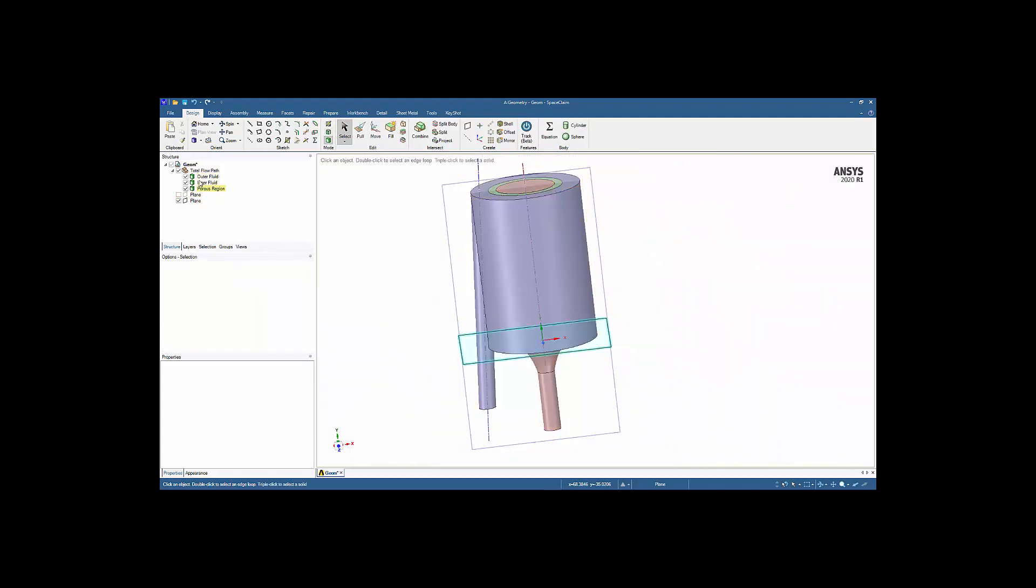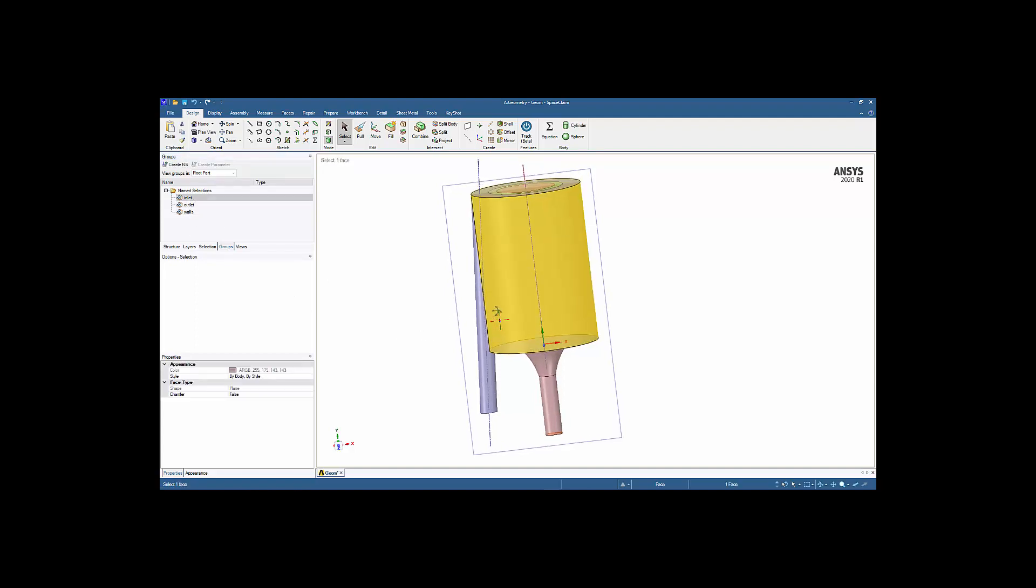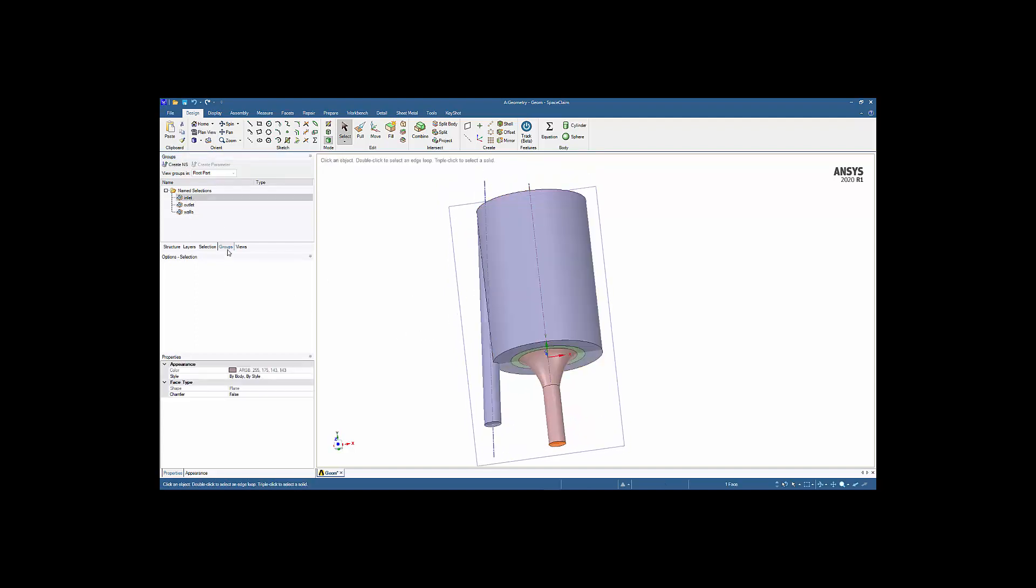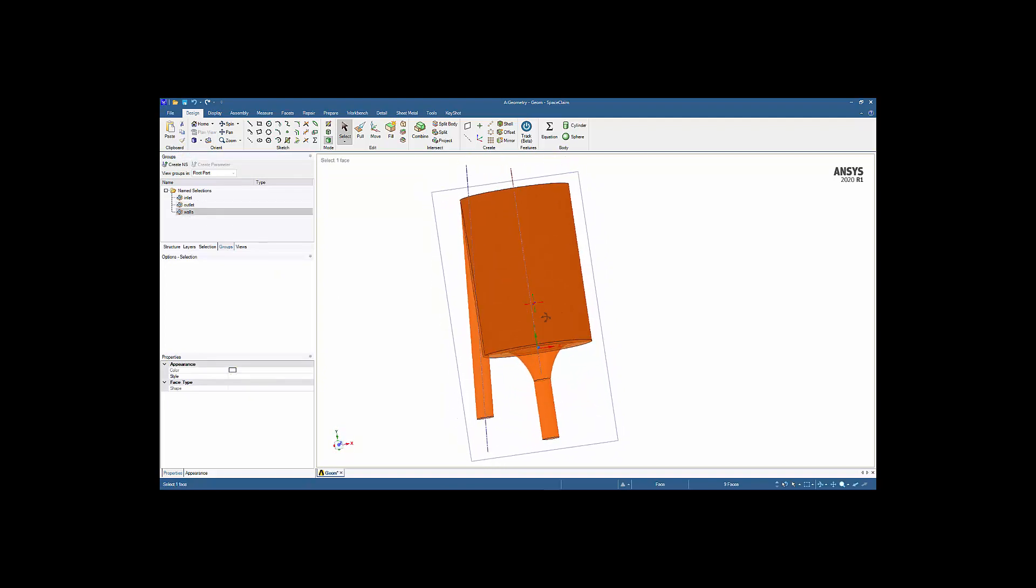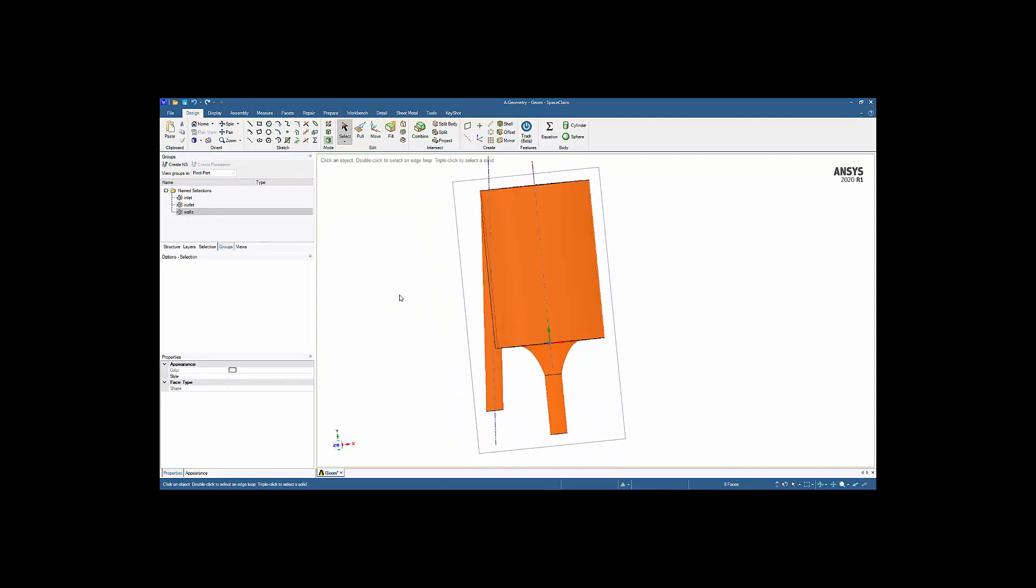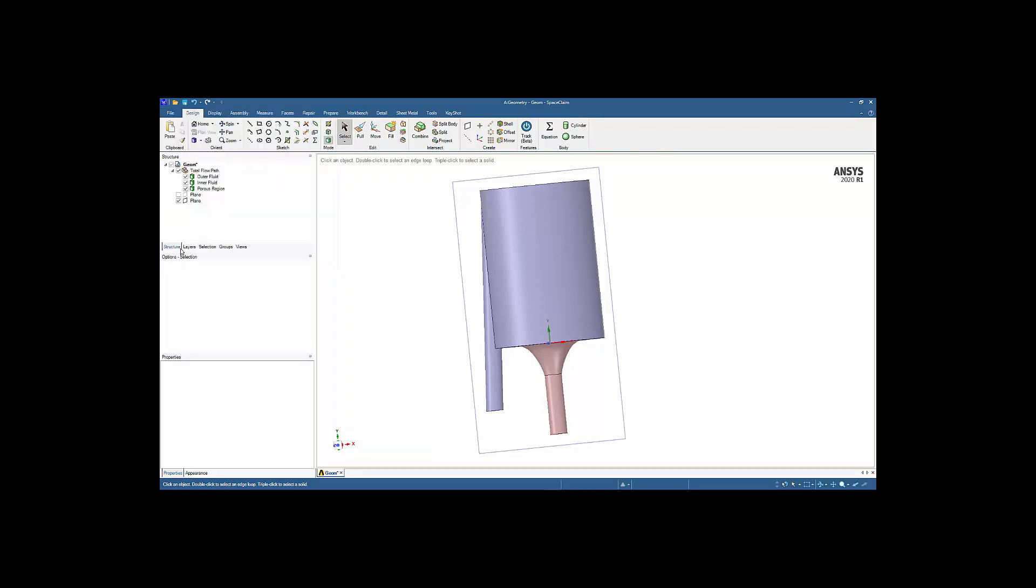So I'm going to go back and go to 3D mode. And then the other thing I'd like to point out here is under the groups area. That's where we create our name selections, which will be carried forward into Fluent meshing and then into Fluent. We have our inlet on the bottom, we have our outlet, and then we have the walls, all the surrounding walls of the design. So with that, really, this is a very simple geometry. We're going to close out Space Claim now and then move over to the Fluent meshing.